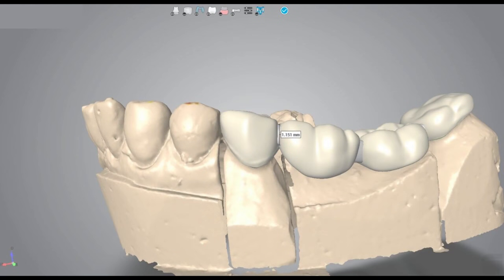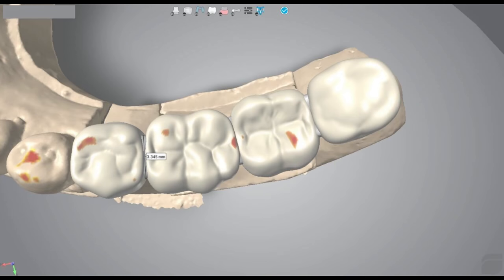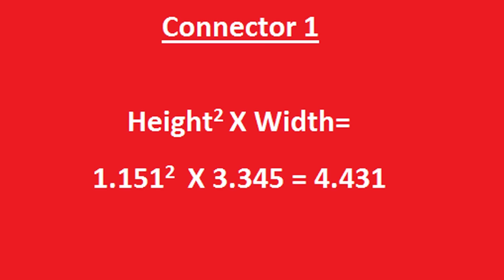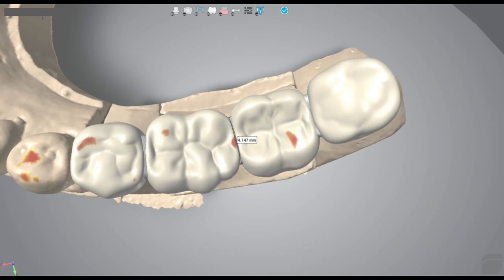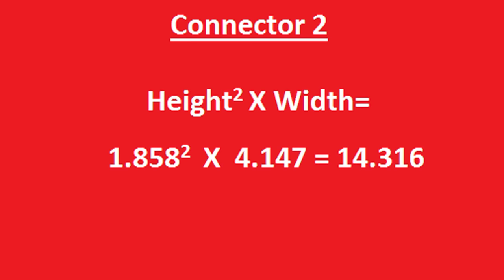This is the first connector which has a height of 1.151 mm according to the software and it has a width of 3.345 mm. So now we multiply the square of the height with the width to get a value which is 4.431. This value is less than 27, which means that this connector is not strong enough for the bridge to be successful. Let's have a closer look at the second connector now. It has a height of 1.858 mm and it has a width of 4.147 mm. So when we calculate again, we multiply the square of the height with the width to get a value which is 14.316. Again this connector is very weak because this value is less than 27.